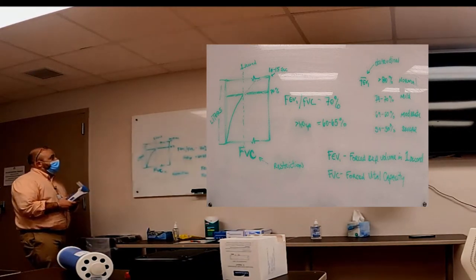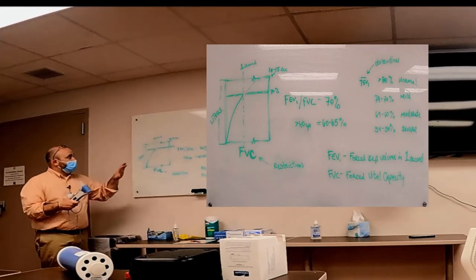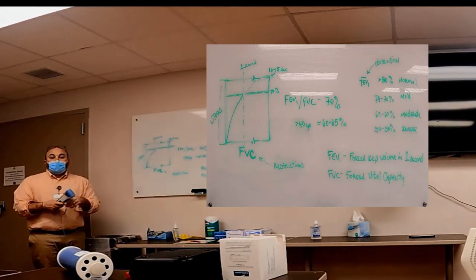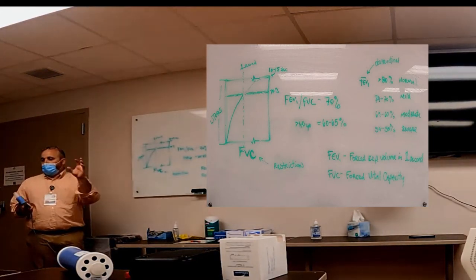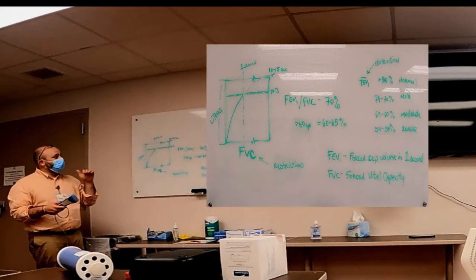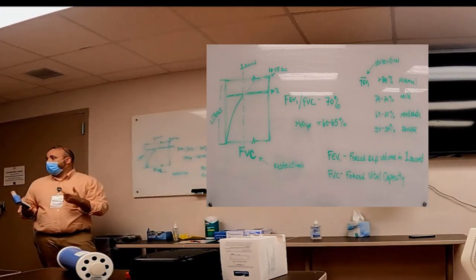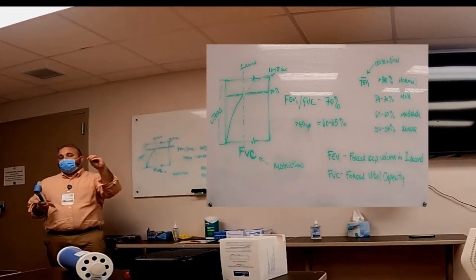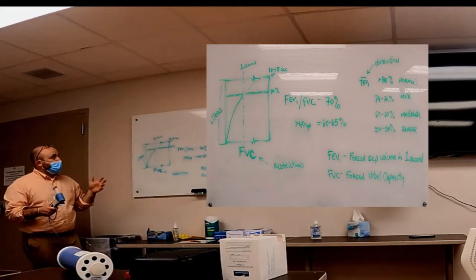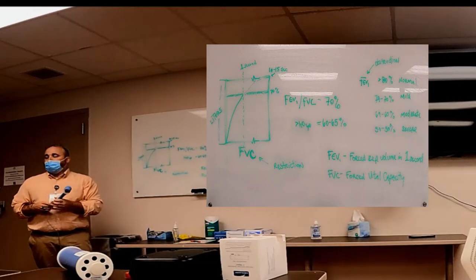So another test that you might do, which I don't think you guys will do, but you could do, is we do this FVC, get the numbers, give somebody a breathing treatment, wait 10 minutes, and do it again. And what that tells us is, it's really cool, you'll actually see the FEV1 change if the breathing treatment works. So their flows will get faster, and if they get 12% faster, it is a black and white indication that they need breathing treatments.